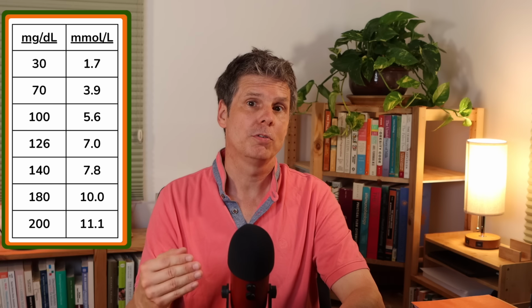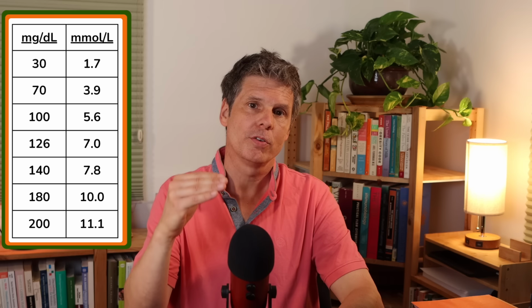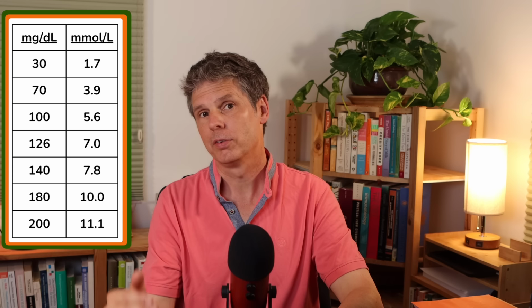So if you have been following a low-carb diet and would like to get a sense of your glucose tolerance, introduce small amounts of carbs slowly over several weeks, and then start eating a normal diet with higher carbohydrate content again, and only then use a CGM to measure your glucose responses to these higher carb meals.